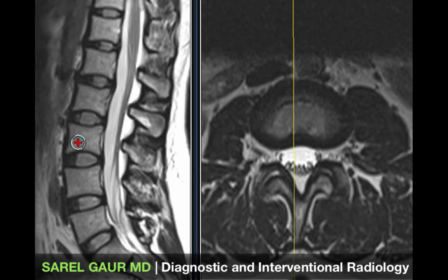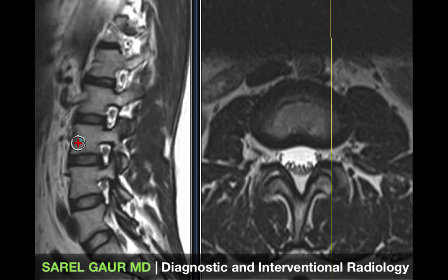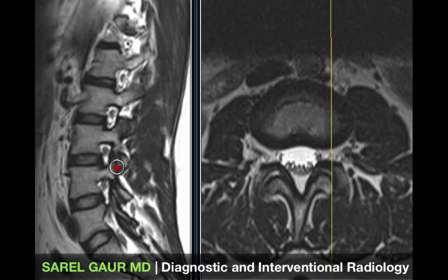As we scroll through the sagittal images and come out laterally, you can see how a portion of the vertebral body projects posteriorly — this is called the pedicle. As it comes out posteriorly it also goes superiorly and inferiorly and forms facet joints which connect between each vertebral level.